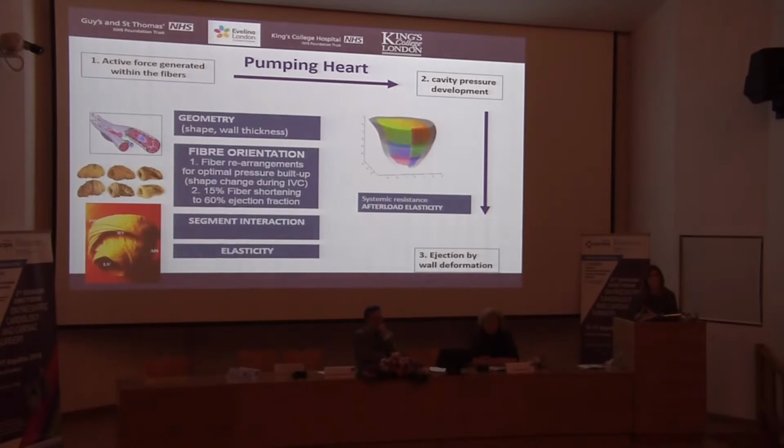It is very important for an appropriate ejection to have synchronous deformation of the different myocardial segments, and the wall elasticity is also very important. Now, in congenital heart disease patients, any of these parameters can go wrong.